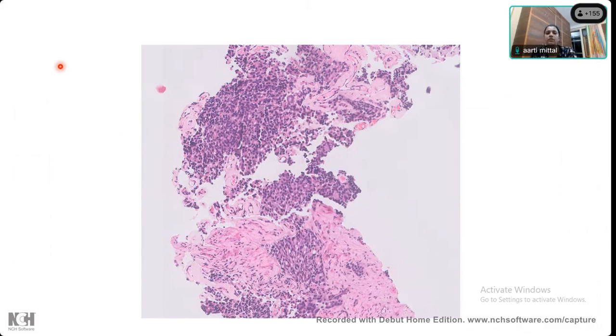Is NKX 3.1 a better marker for prostatic adenocarcinoma? NKX 3.1 is a good marker, I would say. I use it pretty much, especially in metastatic sites. If you want to pick up prostate cancer, NKX 3.1 is a good marker. Generally, for a clear-cut Gleason tumor, 3, 4 and so on, which we can see on morphology, we don't use NKX at all. NKX 3.1 is used to distinguish from urothelial cancer or some other type of cancer, and for metastasis.